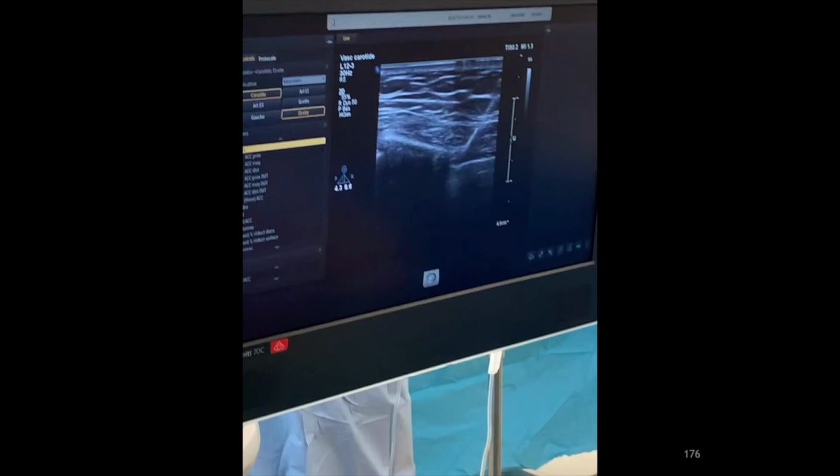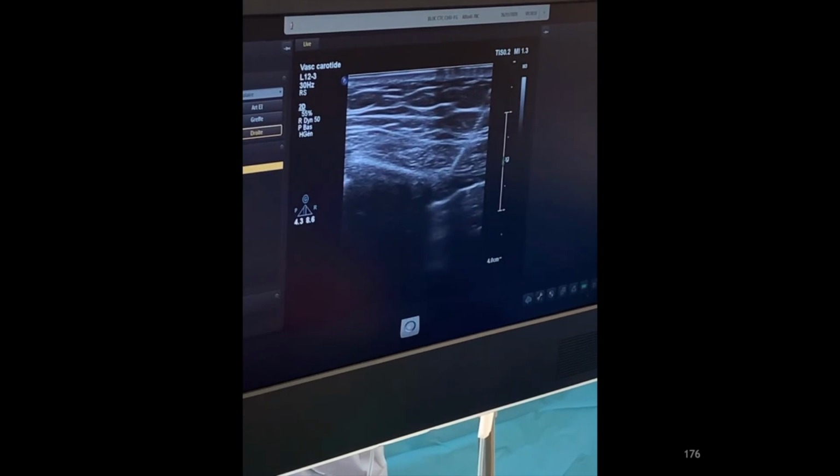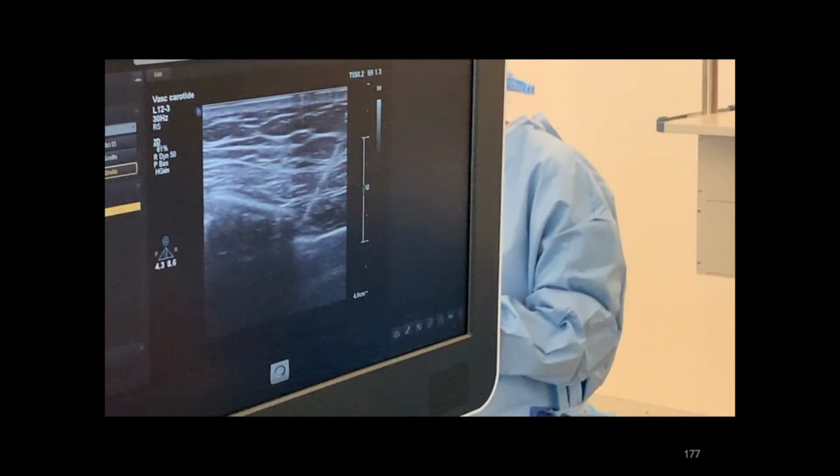This real-time ultrasound video shows downward displacement of the pleura during injection, which confirms correct deposition of local anesthetics into the transversus thoracic plane. So here again, the right shot at the right place, leading to the right block.